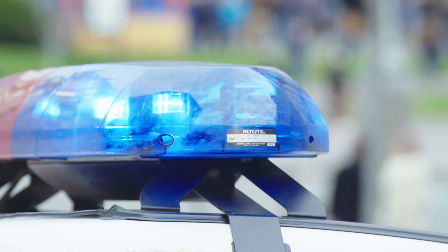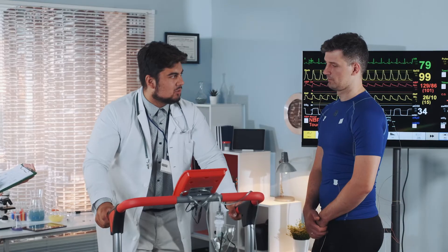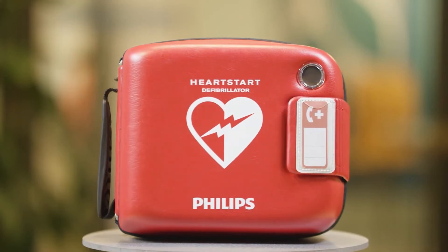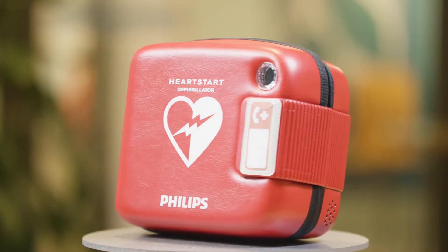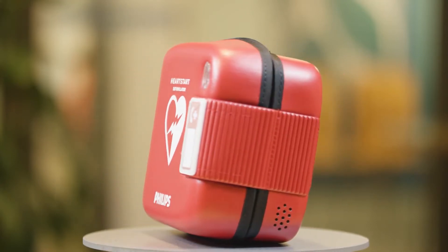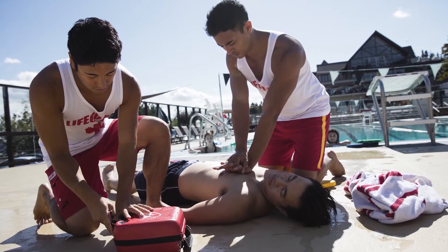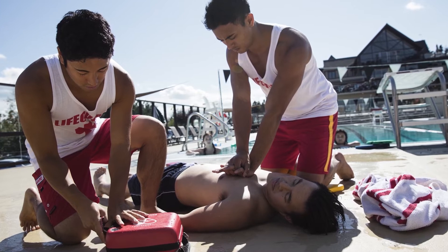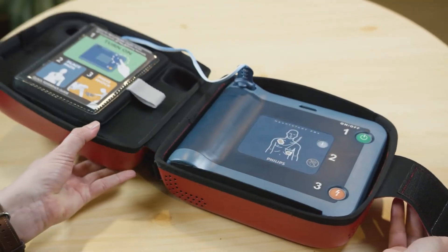Whether it's the police, firefighters, or even a sports physician, the Philips HeartStart FRX is ready to be used by professionals who are already equipped with AED and CPR training. Let's talk about how to properly use the Philips HeartStart FRX, when to use it, and how to care for the unit so that it is ready in case of a cardiac emergency.